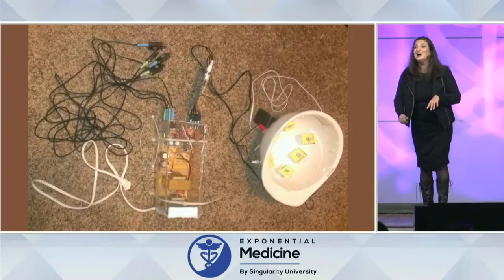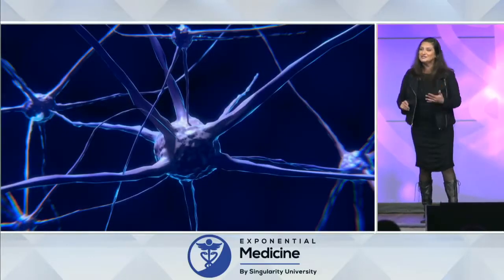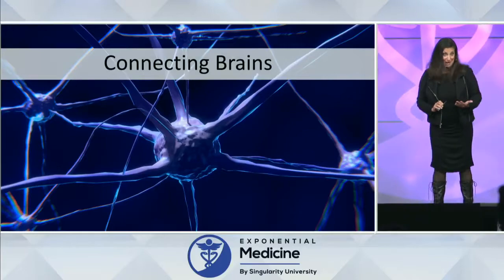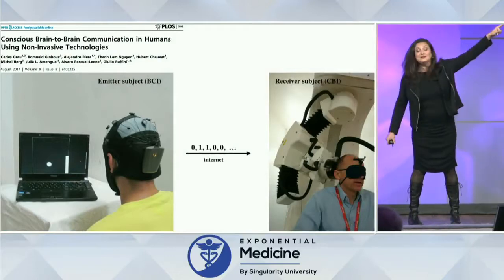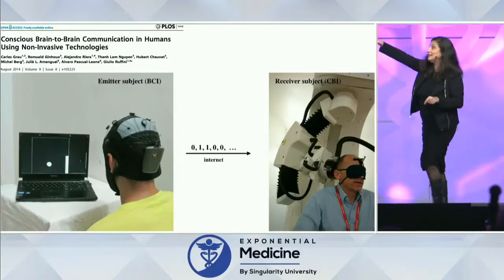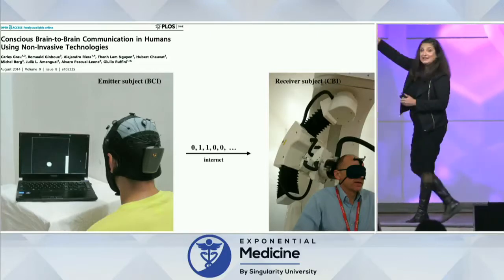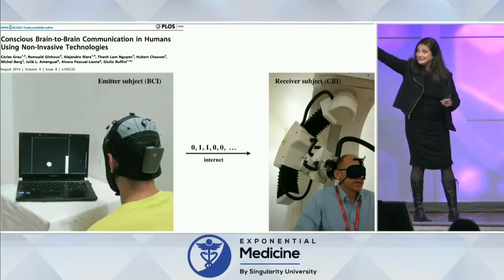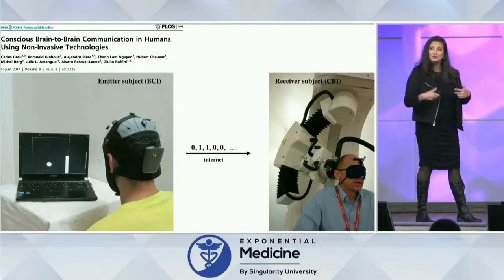Just saying. I'm going to close with a really funky approach and application to non-invasive modulation, and that is connecting brains. The very first telepathy experiments have been done using non-invasive neuromodulation. Here's one of them in 2014. Basically, a subject is using an EEG cap to actually send thoughts to a subject receiving it. Doesn't matter if they're in the next room or in another country, as long as there's an internet connection. That guy has a transcranial magnetic stimulator at the back of his head. It's receiving the bits of information being sent and stimulating the back of his visual cortex to generate phosphenes so he knows whether the bit's a 1 or a 0.